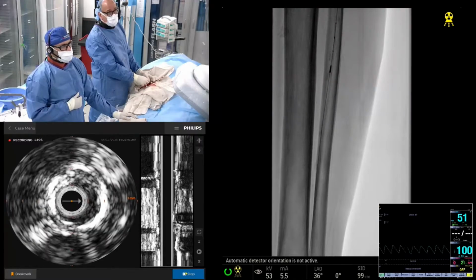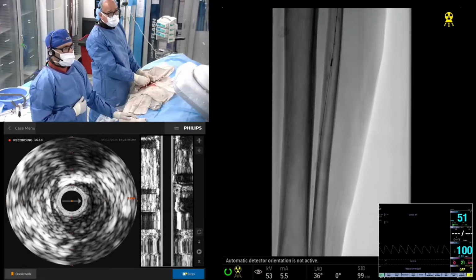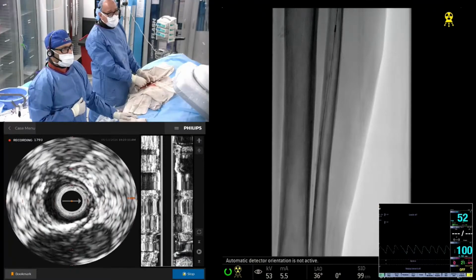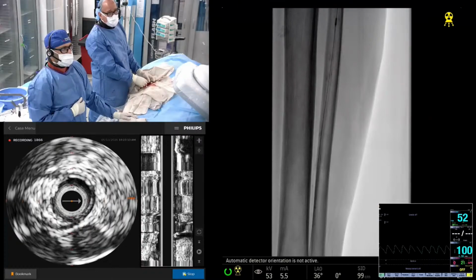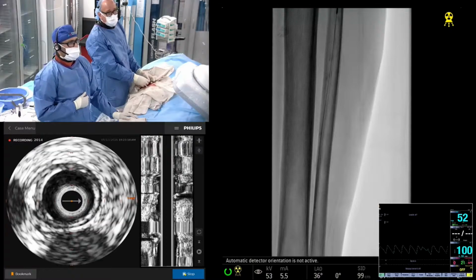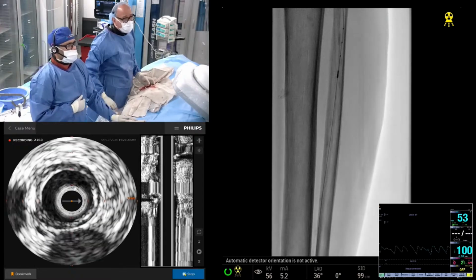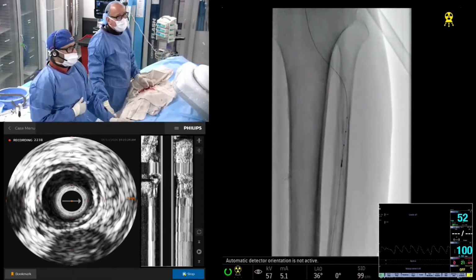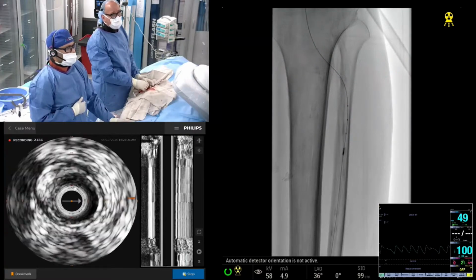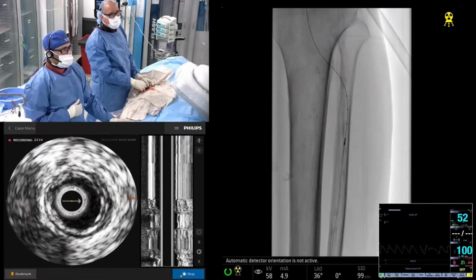And clearly a bigger lumen up here. And again, this area here, that's a much larger lumen. A lot of soft plaque in that. And again, you might look at the angiogram and say you need a 2 millimeter balloon, but it's so obvious to me on this IVUS. Here's a great example. This is clearly a 3 millimeter lumen. And again, we're in the vertical portion of the AT, but we're really sizing up what we're going to use here. Look at how much plaque is here in this area, and how much luminal gain there's potential for here.